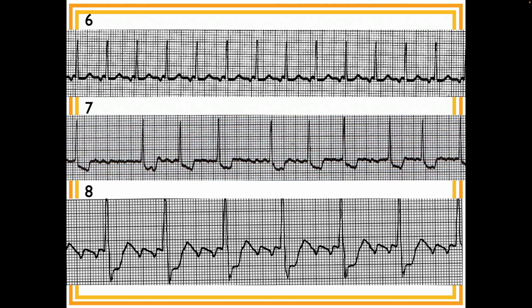Finally, this is irregularly irregular. That doesn't mean that everything has to be different. It's just random, meaning that sometimes there can be some similarities. So don't stretch to find the pattern. Yes, that's good. I'll steal that. That's a good line.